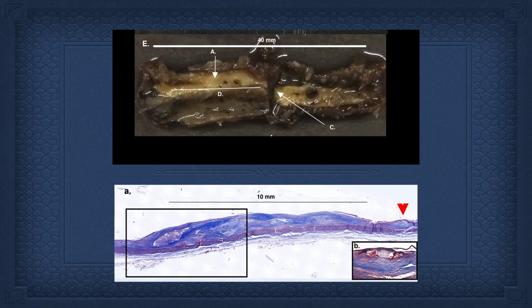And this thing is going to be dangerous as it extends from the left main down the coronary. And core composition, I've already said I don't believe in the diffuse border criteria for identifying necrotic cores. So a core that's very long has varying composition, and it can all be lipid, quote, lipid core. It could be PIT, which is lipid. It could be xanthomas, which is lipid. It could be true necrosis, early necrosis, late necrosis. The left shows late necrosis. And this plaque on the bottom with trichrome shows the various stages.